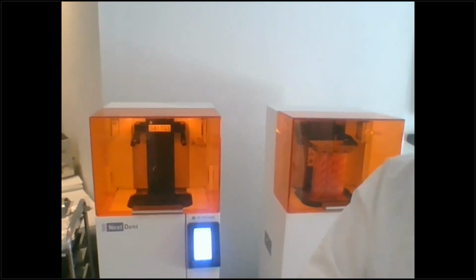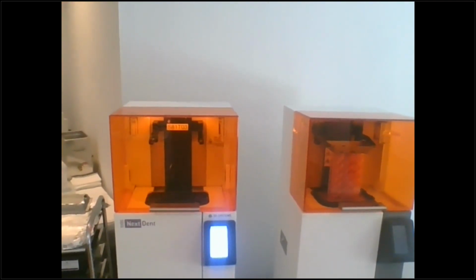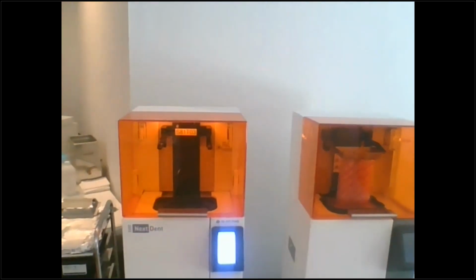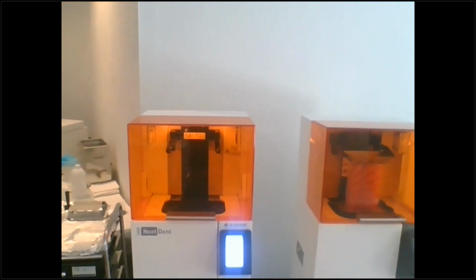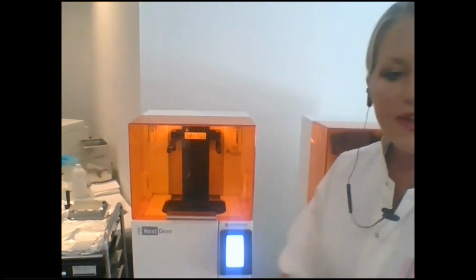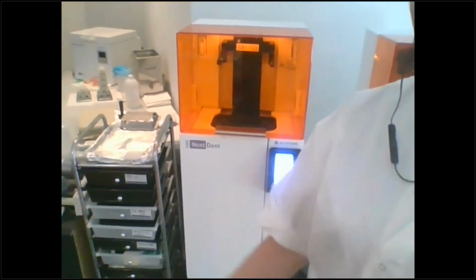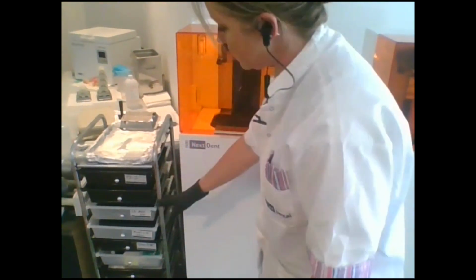So here's what I have. I have my little setup, and if you guys have joined me before, you know I'm working in my home office. So it's not set up completely like a lab, but I want to show you a couple of little helpful things that I do, and I did it in the lab as well. So what we have here, I have two Nextdent printers, and I have a little cart, and I have them all labeled with all of my different materials. So I have 4 different materials and resin trays.